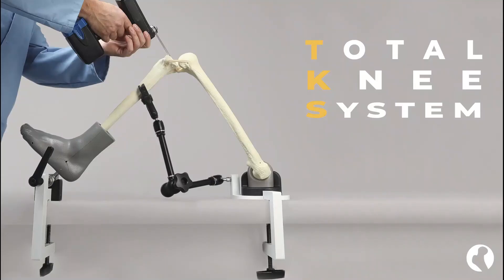Once the TKS is set up, surgical navigation and various procedures for total knee replacement can be repetitively practiced and demonstrated.